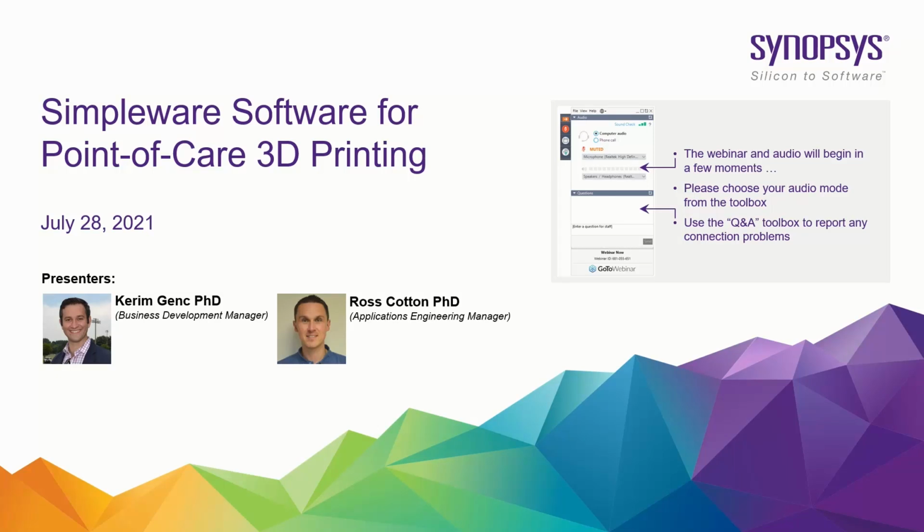Today we'll be talking about Simpleware Software for point-of-care 3D printing, or anatomical 3D printing as well.